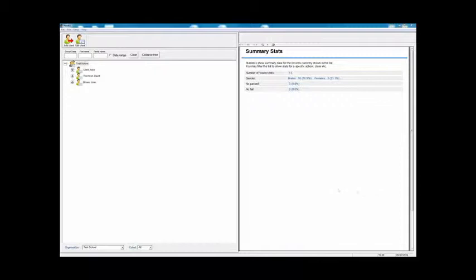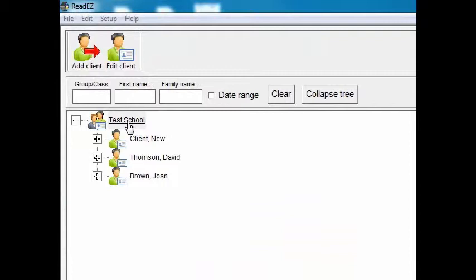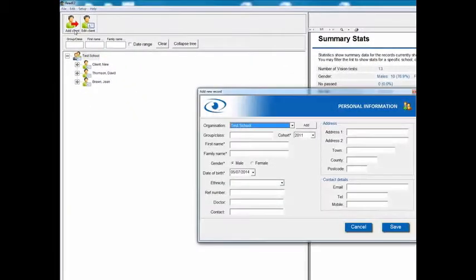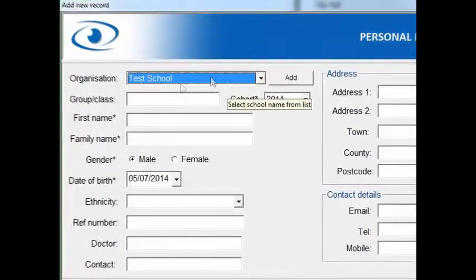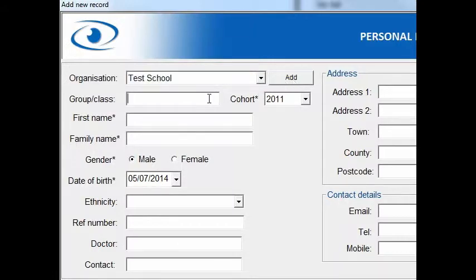When you've installed the program, the first screen that you'll see will be something like this. At the top level, you'll see that you've got your organization name, which might be your practice name if you're an optician, or it might be a school name. The first stage then is to add a client or a patient to that organization, so you just click on Add Client. The organizations that are available will be at the top there, and if you haven't yet defined an organization, you can add it at this stage.